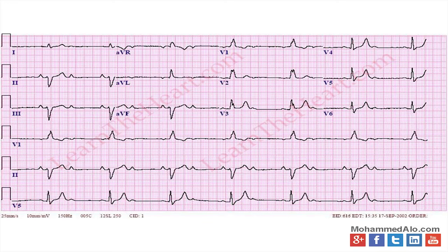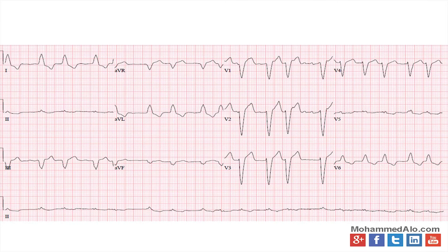And in this case, it really depends on if it's the AV node or infra-Hisian or below the AV node. That would really determine whether or not this patient needs a pacemaker or what exactly this is. And we have ways of testing that. Next rhythm here is also wide.